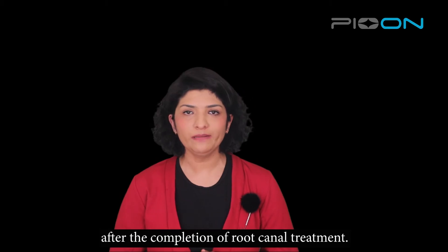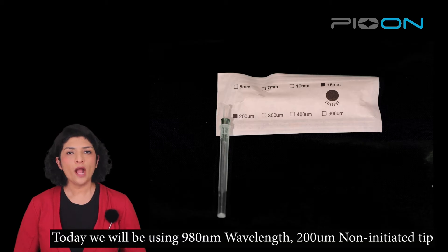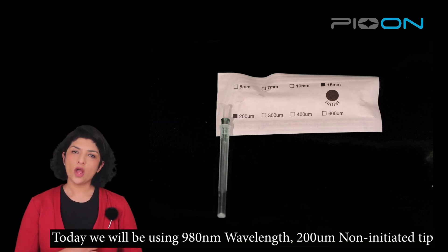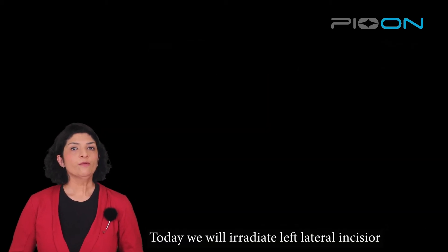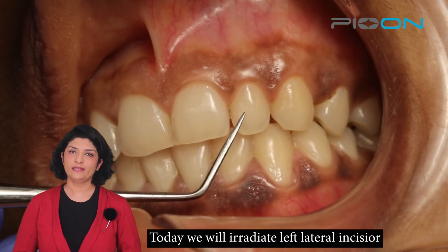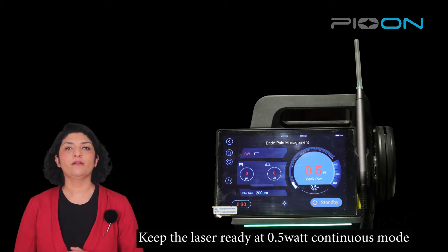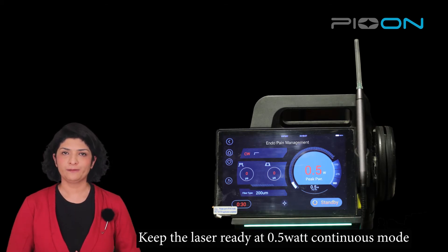Today we will be using a 980 nanometer, 200 micron tip, non-initiated. We will be doing laser irradiation for the left lateral incisor. For this, you have to keep the laser ready at the following settings.